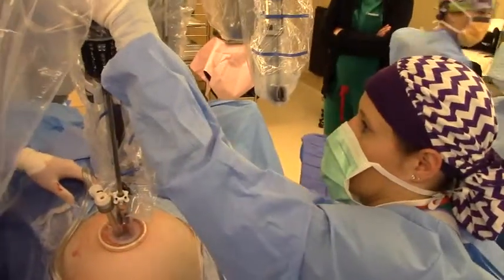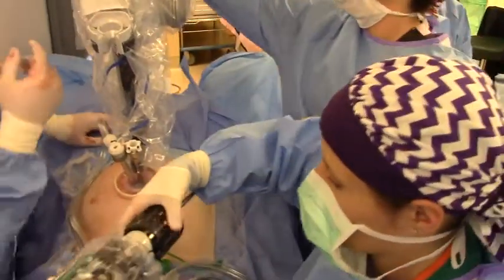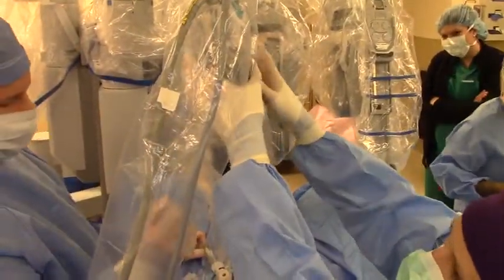So that's how you do your side docking, essentially. And what's so important is that the joint right there being straightened is fit with the leg. We don't even worry about the sweet spot until after we get all our arms in. And then we'll adjust this to set the sweet spot.